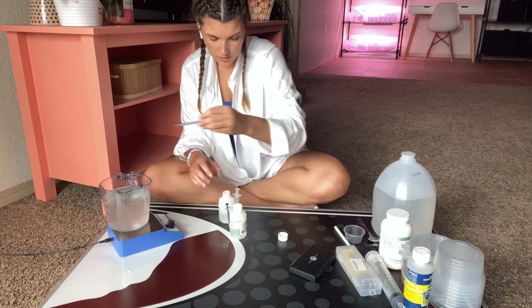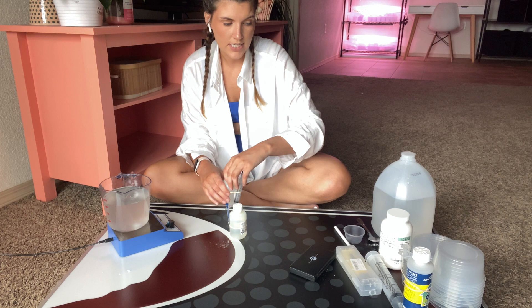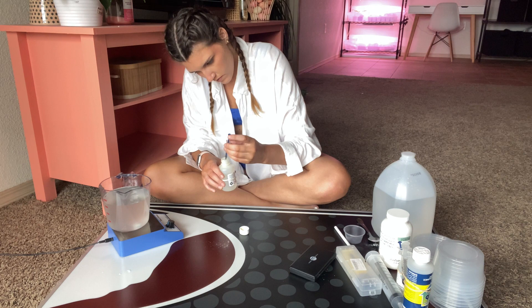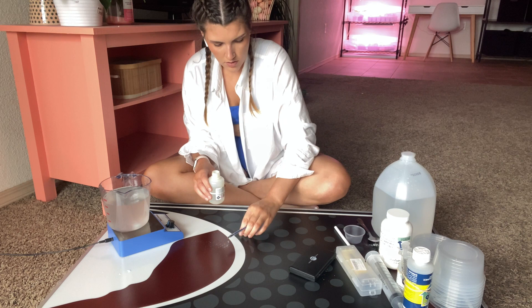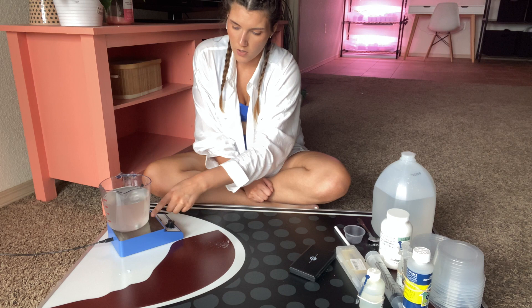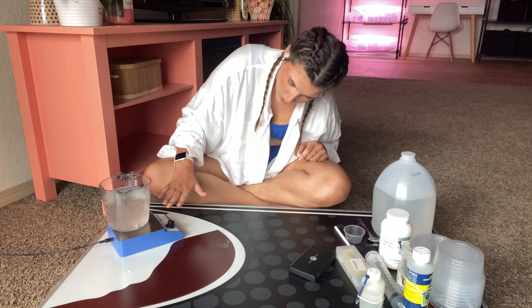We're adding one milliliter of BA per liter of media. Then I'm going to take the NAA and we're going to do 0.1 milliliters — just a teeny tiny bit. Then I'm going to top off the water, filling it all the way up to a liter. I like to turn off the stirrer while I do that just to make sure I'm measuring it accurately.